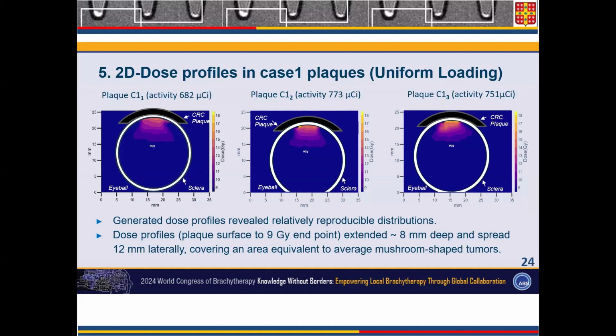So we go to the MRI, we let the radioactive implant on the dosimetric gel for a certain number of hours, usually around 48 hours. And then the little sarcophage or little capsule that contains the hydrogel is inserted into an MRI, and the MRI collects the images, and we reconstruct in 3D the dose profile. So where the energy has deposited at a very high level, you have the red, and where there's a low deposition of energy, it is far from the radioactive plaque.